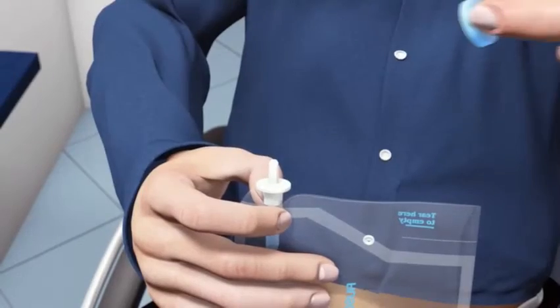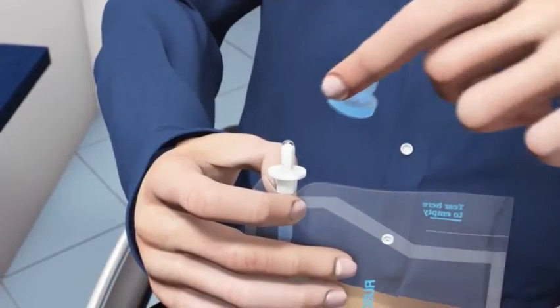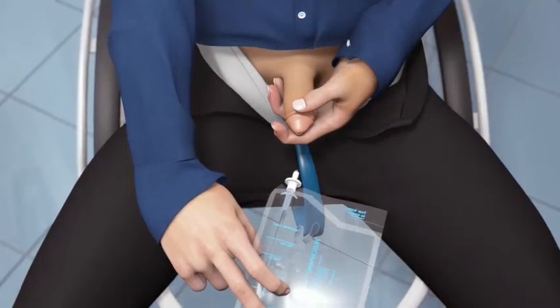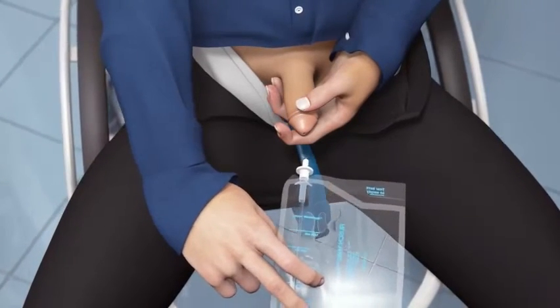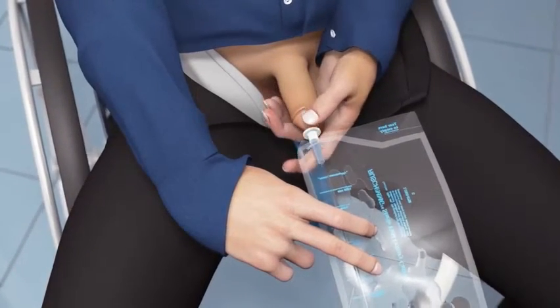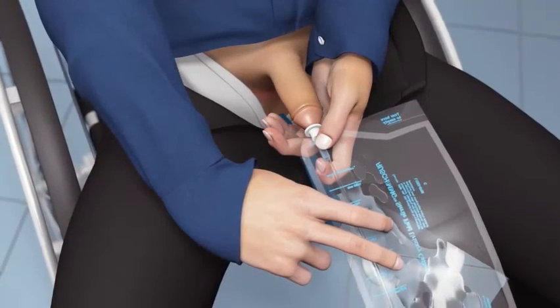If needed, add some extra gel to the introducer tip. The gel can be found inside the protective cap. If right-handed, using your middle, ring, and smallest fingers, hold the penis with your left hand. Insert the soft silicone tip into the urethral opening using your right hand to guide the tip in. Continue to apply the necessary pressure to ensure that the catheter and silicone introducer tip stay in the urethral opening.